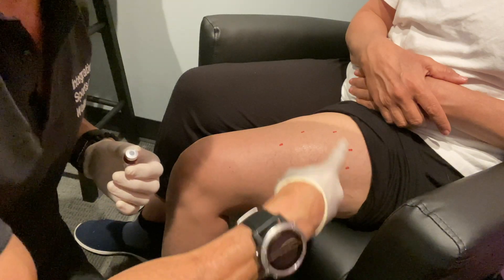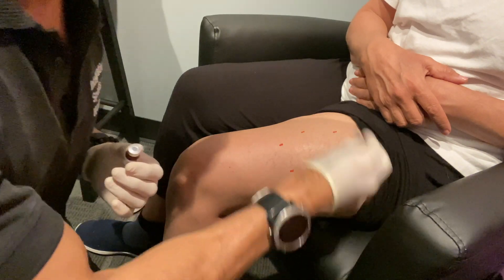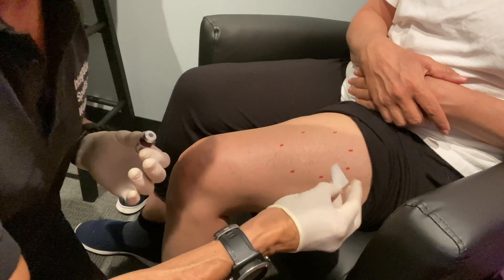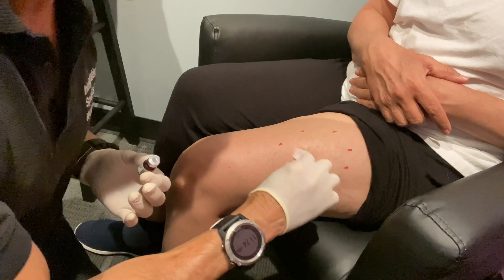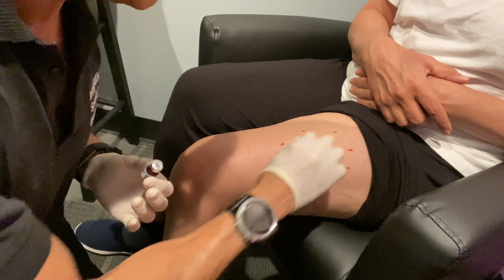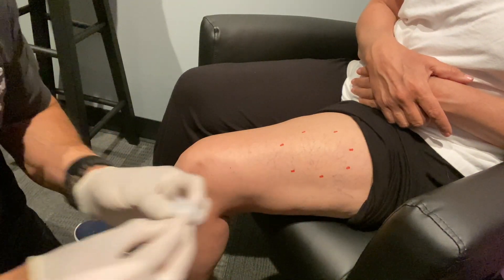For an outer thigh shot, or vastus lateralis shot, as far as intramuscular, first we mark the spot — that's just for you getting to know where you're going, and as you get better at this, I don't think you'll have to mark it. I'm going to try to avoid some big veins. These are not big veins; these are all superficial varicose veins.